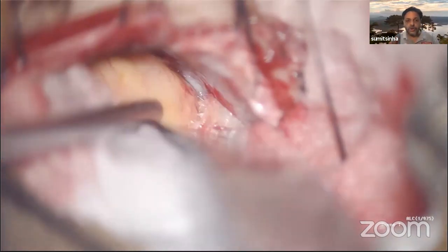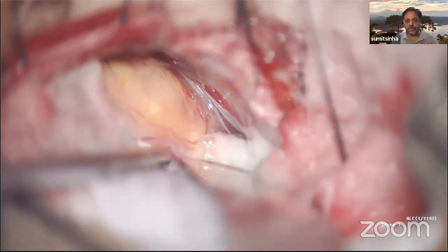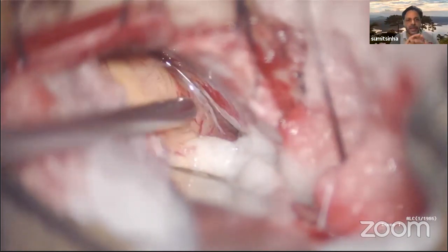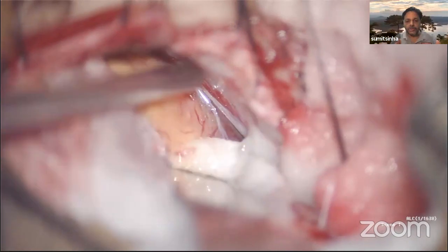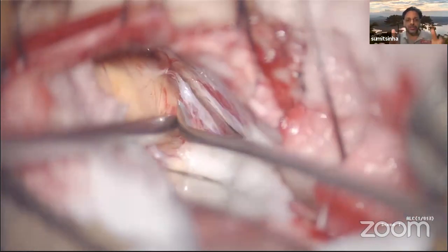Now nowhere during the surgery do you feel compromised about the space here. I mean, the space is as big as you can get in any other routine conventional surgery. So space is not a concern at all in any of the keyhole surgery. At the end of the surgery, you feel like thinking that this exposure, even this exposure, is large enough for this tumor.